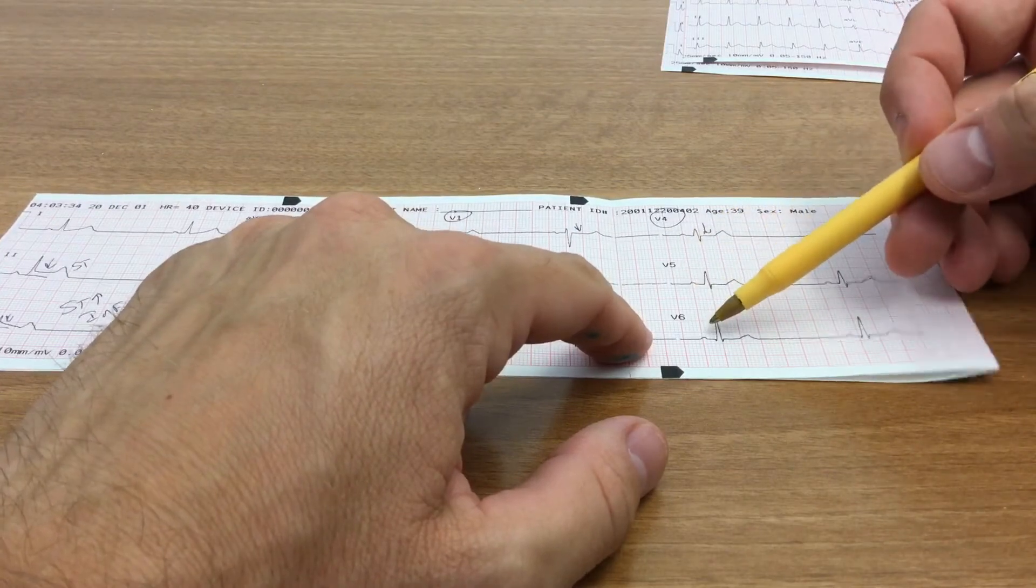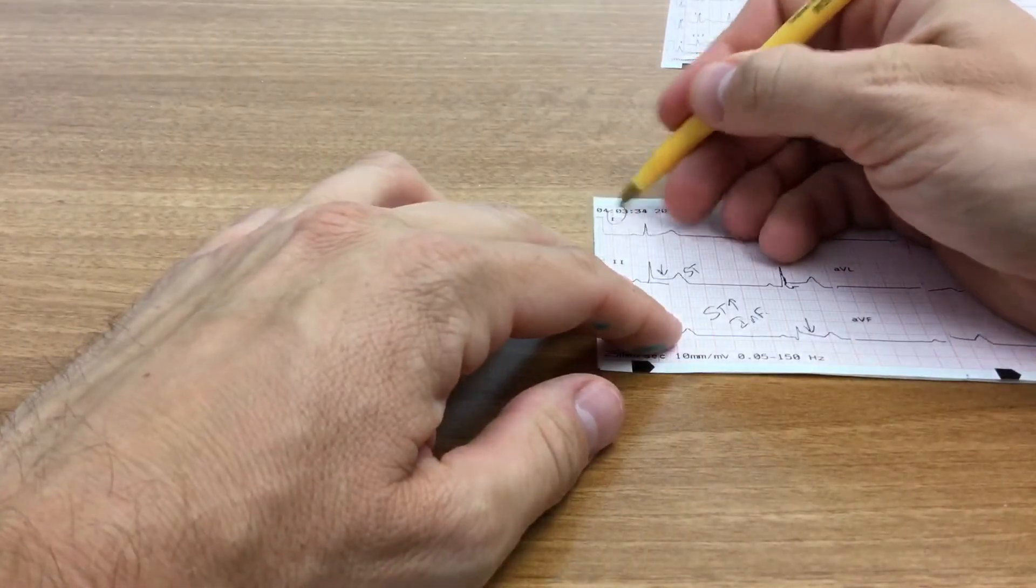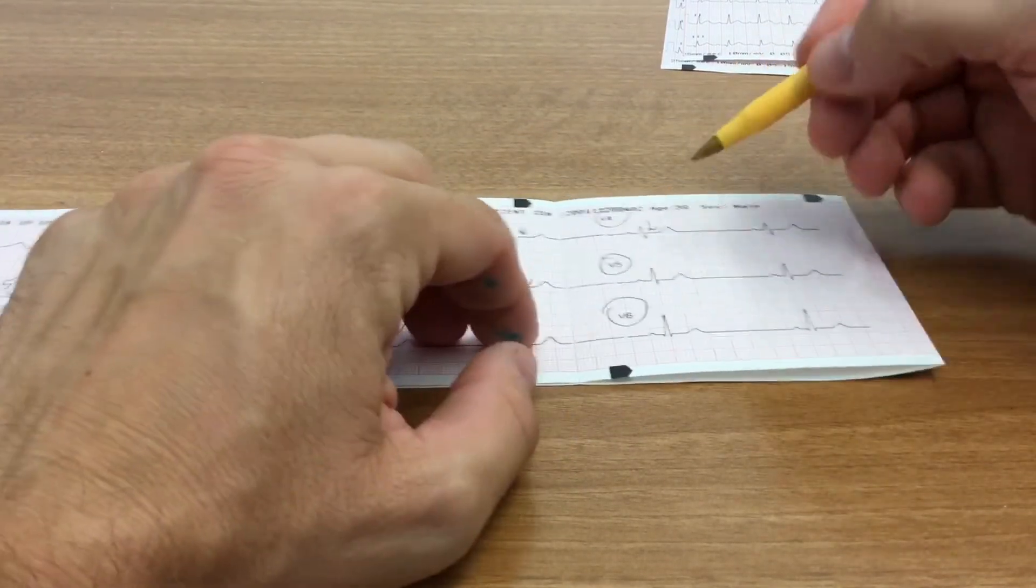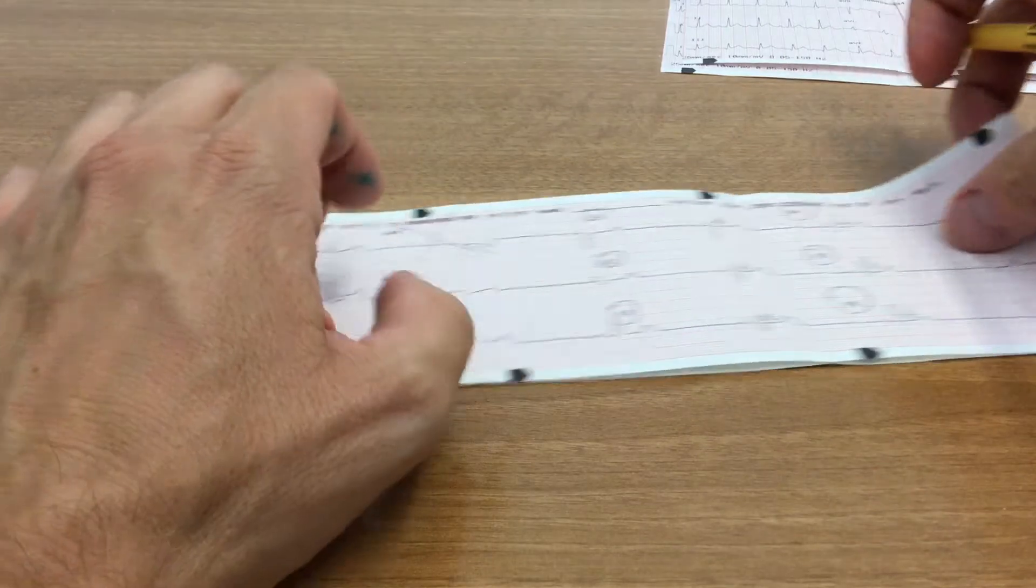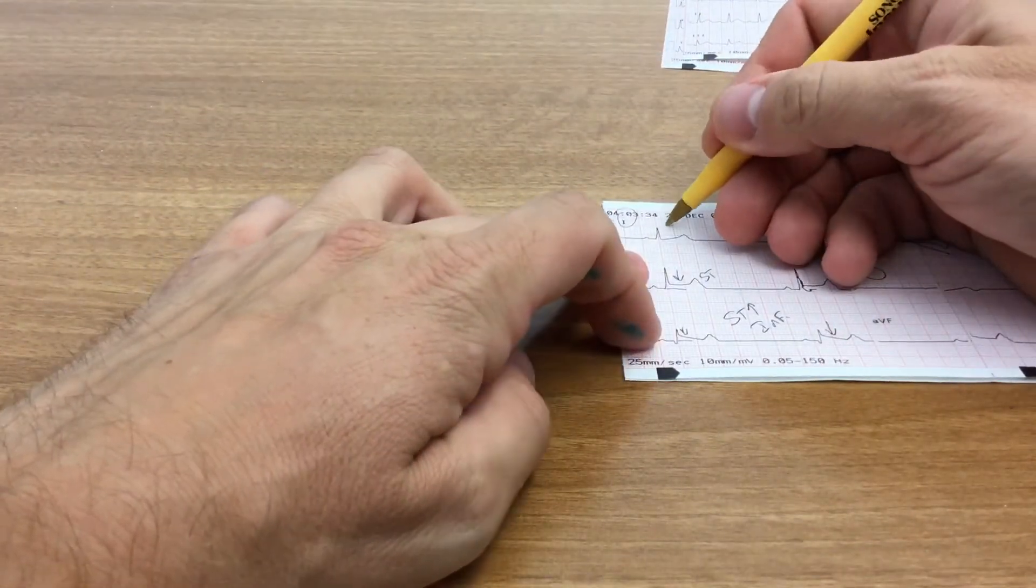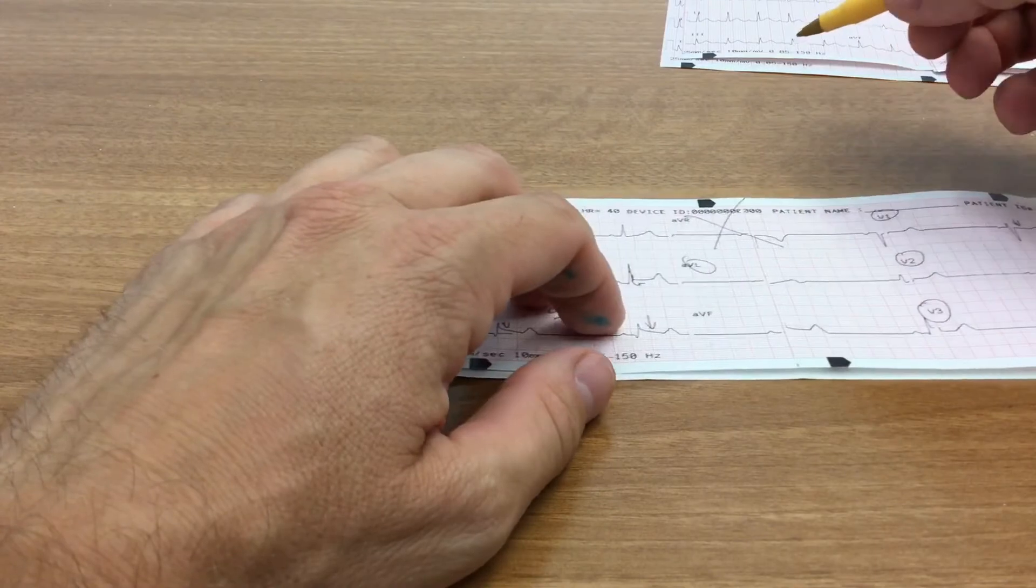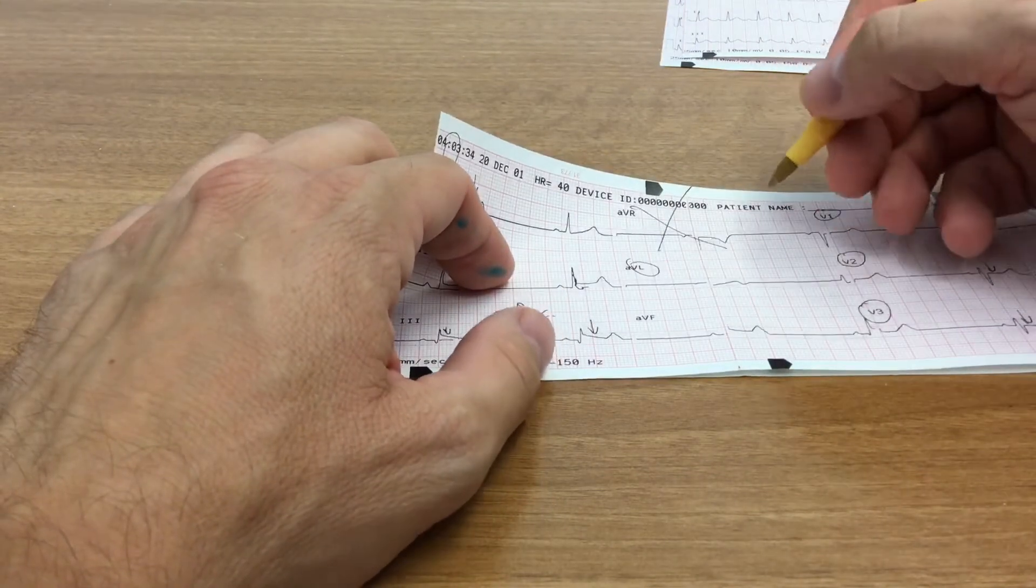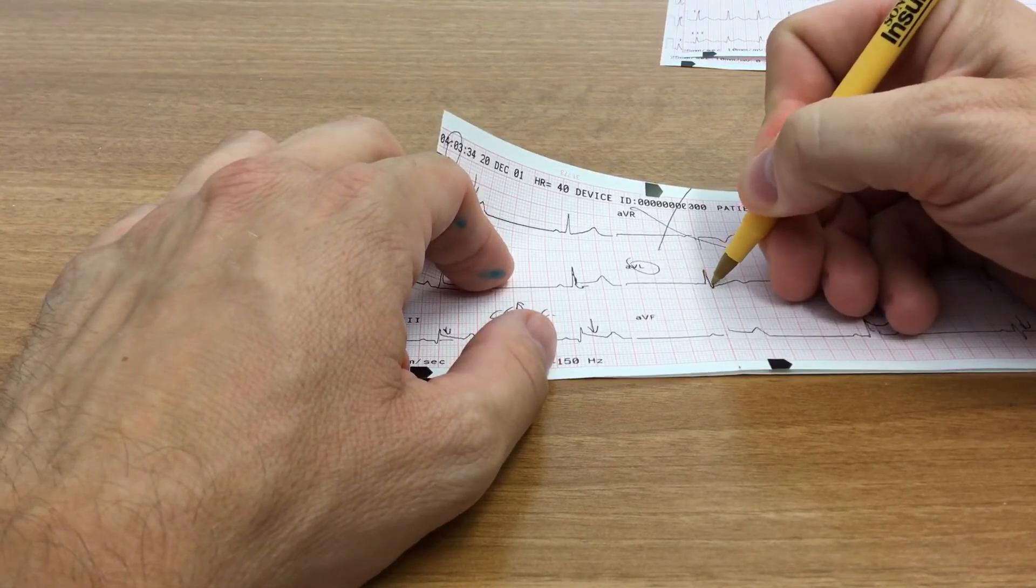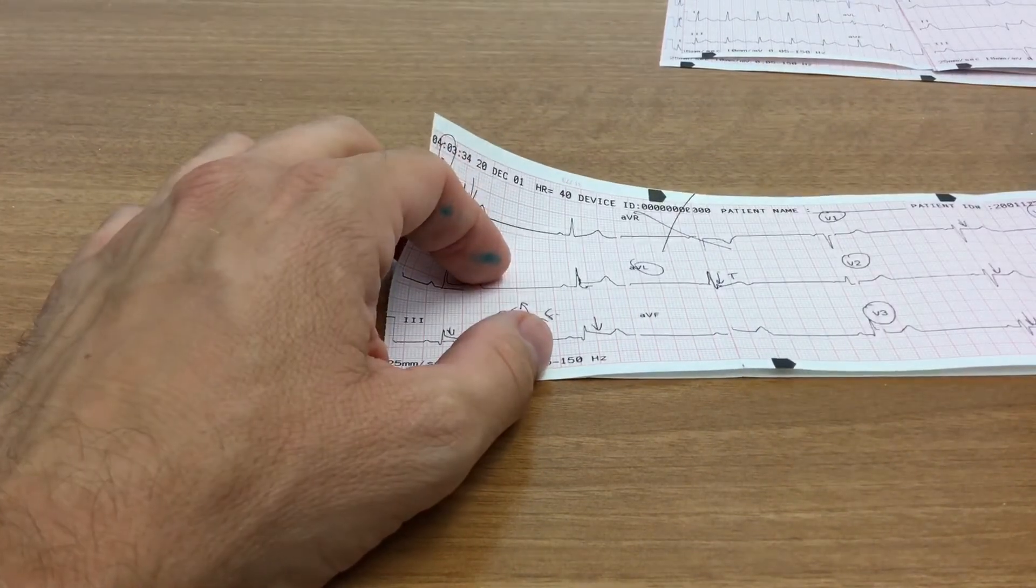And then finally, we'll move on to the lateral wall. V5, V6, 1 in augmented vector left. We don't really use AVR. So let's look at V5 here, normal J-point, V6. J-point's normal. No ST segment elevation or depression there. And then we look at lead one here. Okay. J-point comes down to baseline. And then you go into the T-wave. And then we look at AVL, which I don't actually have a very good... It was right along the line here when I printed it off. But I'll just draw the QRS in here. And you can see that it does return to baseline and then go into the T-wave there. So augmented vector left looks okay too.